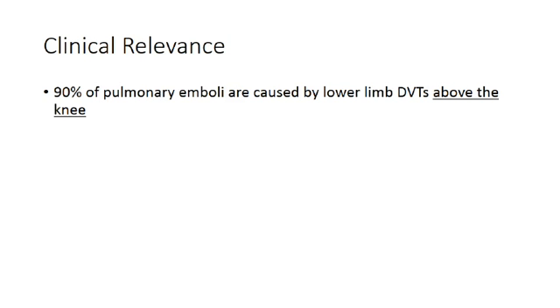What you're interested in is to capture those DVTs that are responsible for pulmonary emboli. And we know that 90% of pulmonary emboli are caused by above knee, lower limb DVTs. And we should be able to capture these even with basic vascular venous Doppler training.